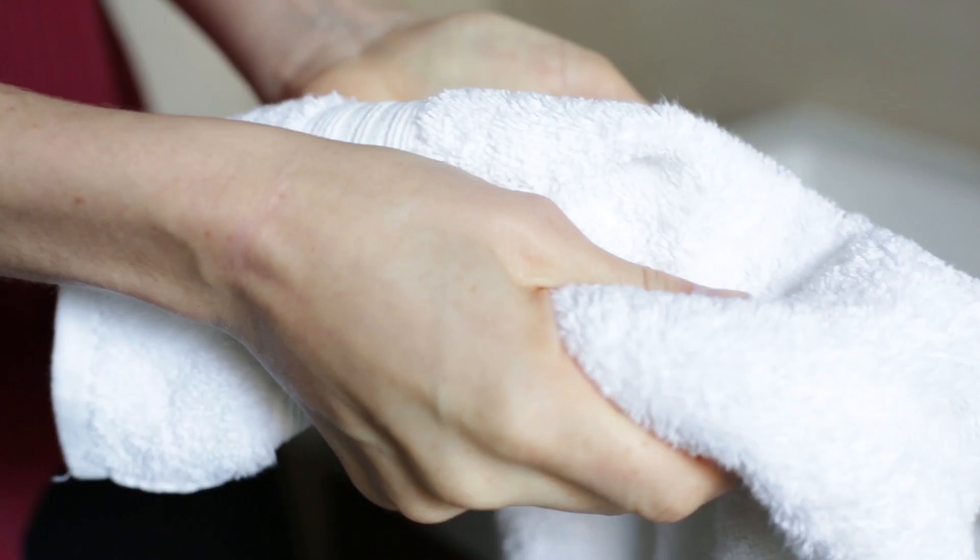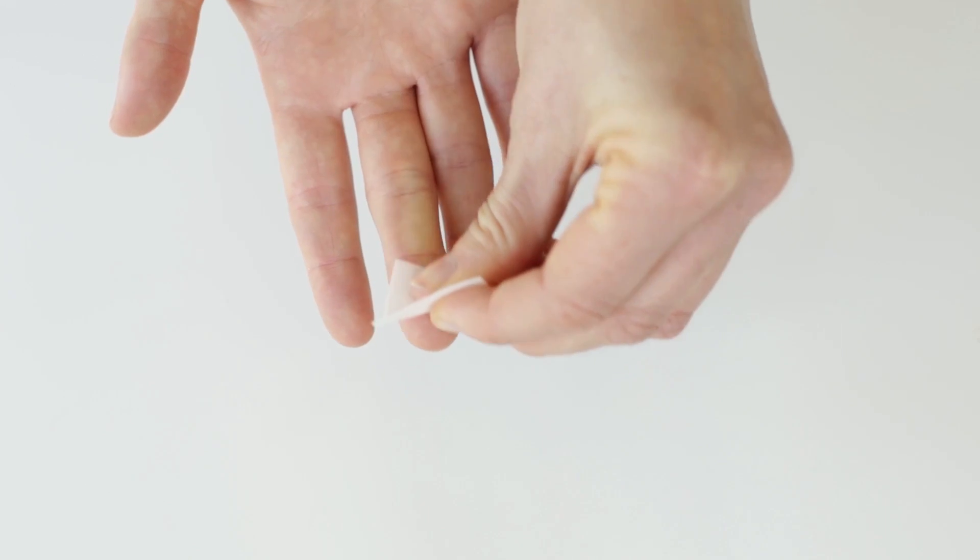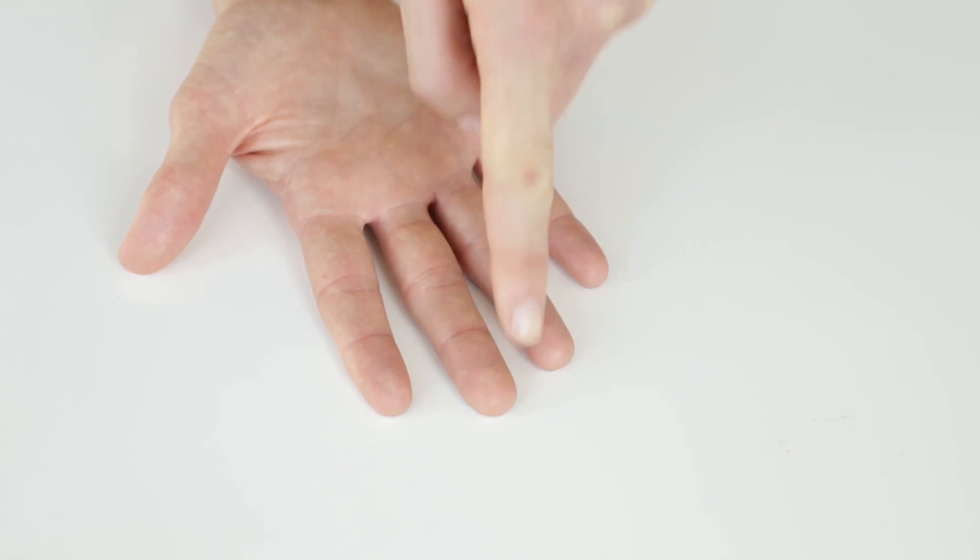Wash and dry your hands and clean your chosen finger with an alcohol wipe. You're going to take blood from one of these two fingers on your least favored hand.